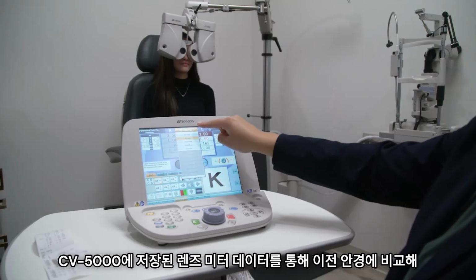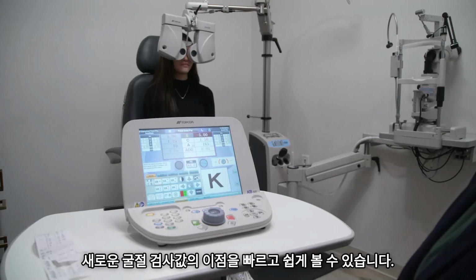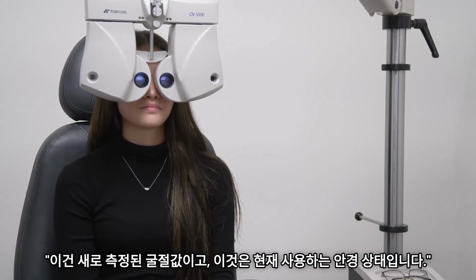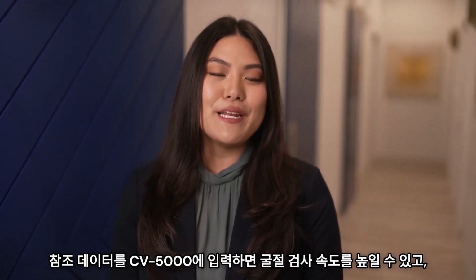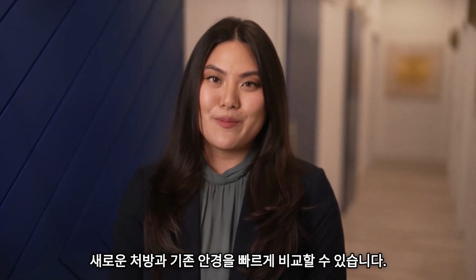With the Lensmeter data stored in the CV5000, it is quick and easy to demonstrate the benefit of the new refraction compared to their previous spectacles. This is your new prescription, and this is your current spectacles. Which do you prefer? And that's how to enter reference data into the CV5000 to speed up refraction and to enable a quick comparison of the new and old prescriptions.